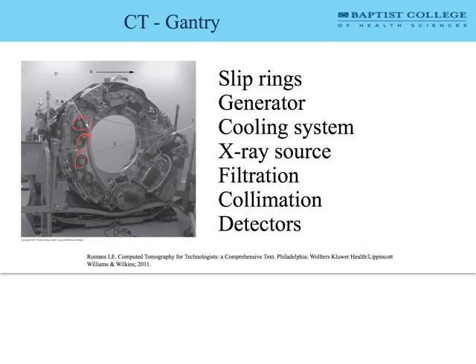And in our case, it's going to be a crystal. When we talk about the whole bank of detectors, the technical term for that is the detector array. So we have a detector array, and if you look at this illustration at the top of page 117, it's showing a bank of things over here receiving the X-ray beams. That would be a detector array.